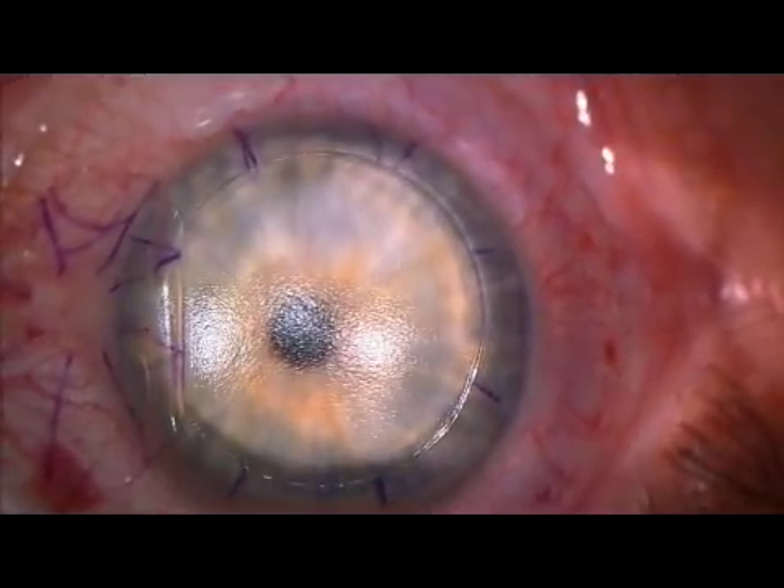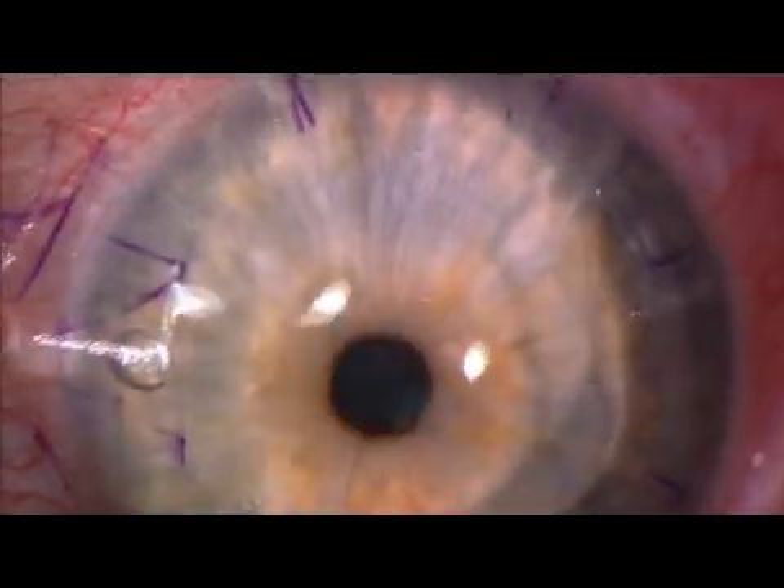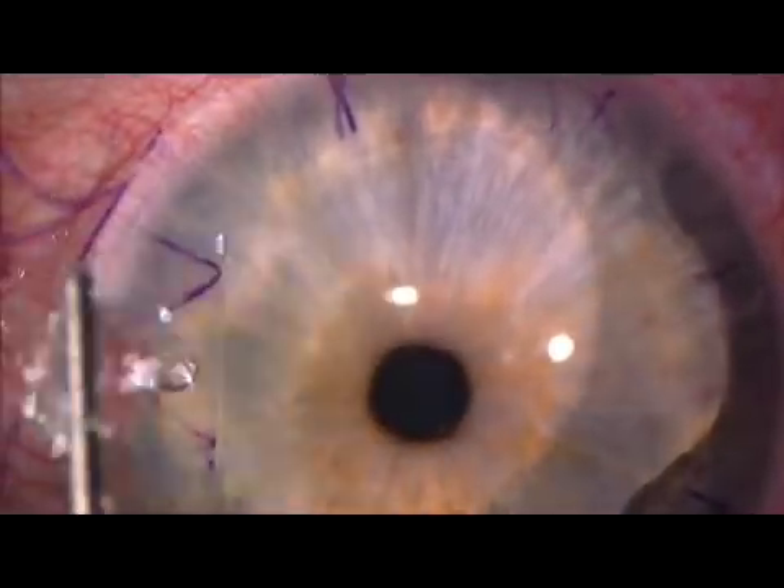The bed is always dry and thus this drying step was not necessary. Higher magnification shows the even texture of the exposed stromal bed. Laser is applied and the flap rehydrated and put back into position.